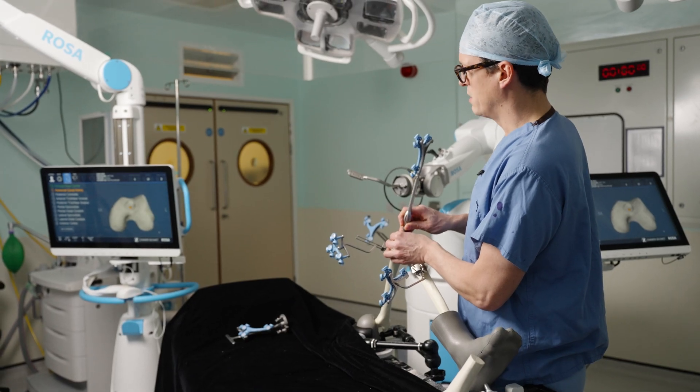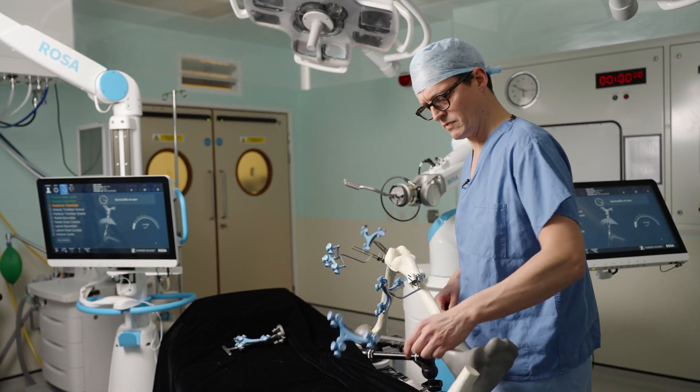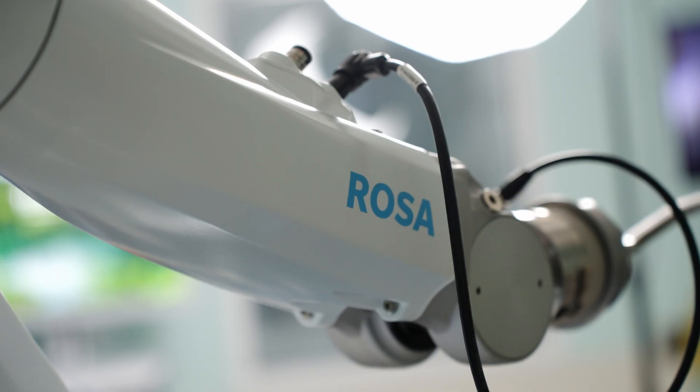I do all of the approach to the operation and prepare the bone surfaces. The robot comes in once the joint's been exposed and guides — and it's important that it guides, it doesn't do. That hopefully will give us far better stability and a more natural outcome, or natural movement of your knee, giving you a better functional outcome in the long term.